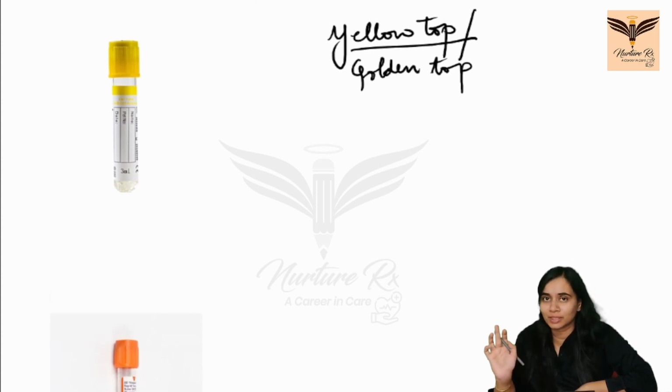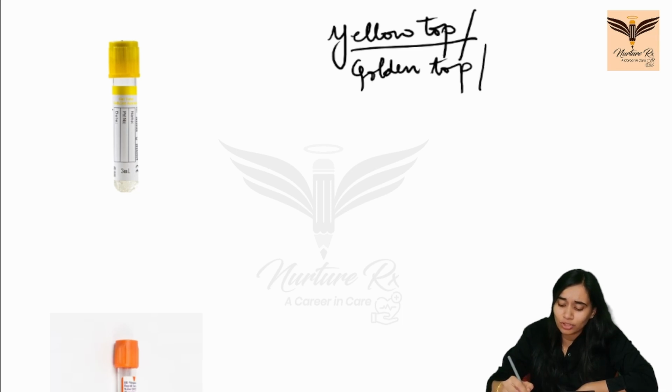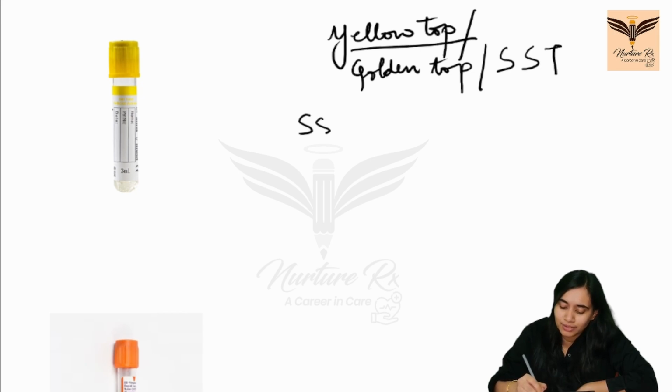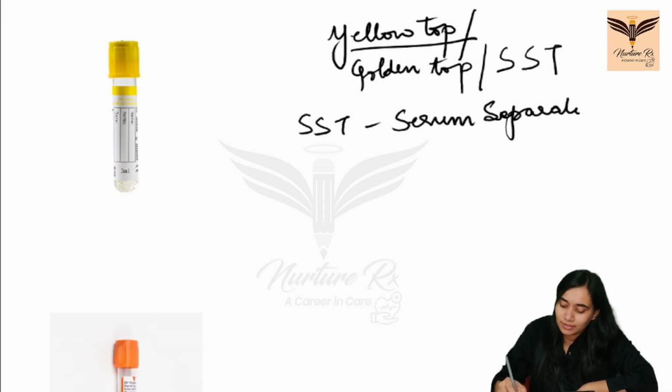Both are serum separators. This is also known as SST. What is SST? Serum separator tube. Okay. Now what are the tests that are done in this?